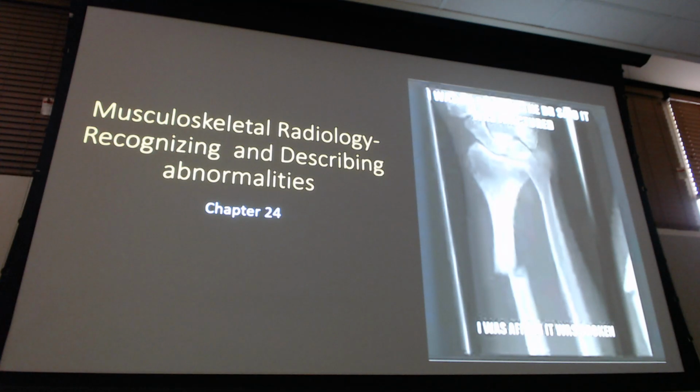When you're going on Radiopaedia and looking up these scaphoid fractures, you may find fractures on there that don't have that sclerotic area. It's because these were fractures that were caught prior to the avascular necrosis happening, because that takes time to happen. That's good news. That's what you want to find.